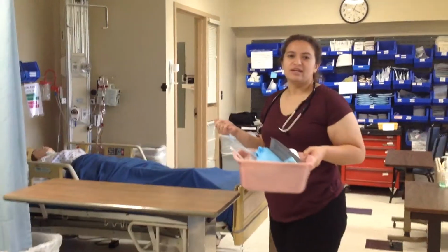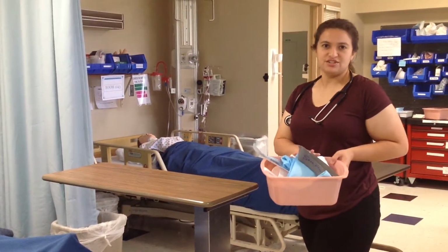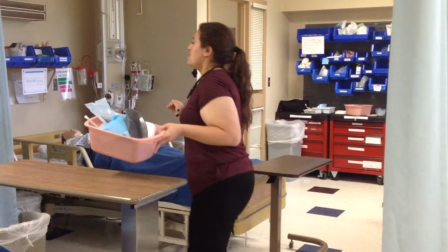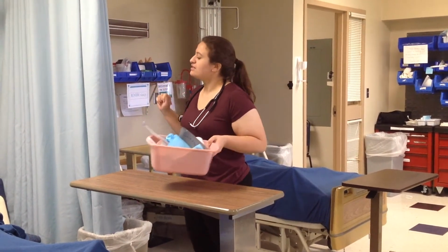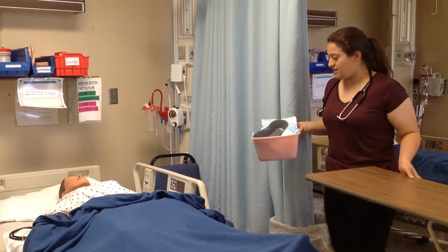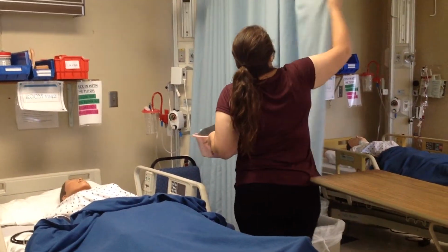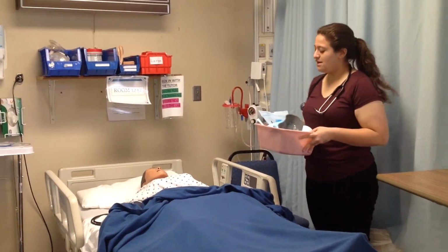First things first, I would make sure to have checked the order for if the patient did actually need an NG tube, so I just would have checked it. And so first things first, I would go ahead and knock on the door. So I would knock, announce myself. Hello, my name is Acacia. I'm going to be your nursing student for today. I'm just going to close this curtain, and that's just going to provide for privacy.